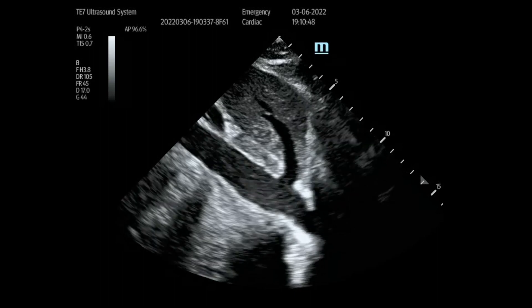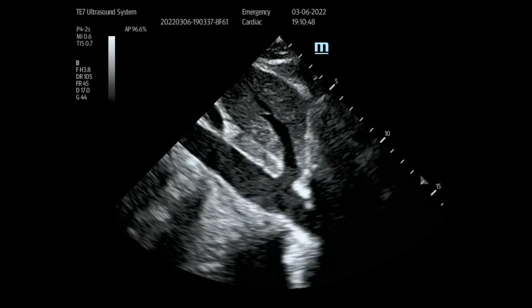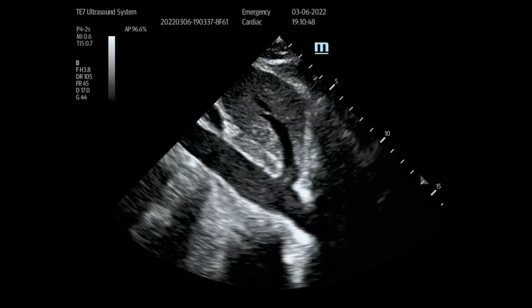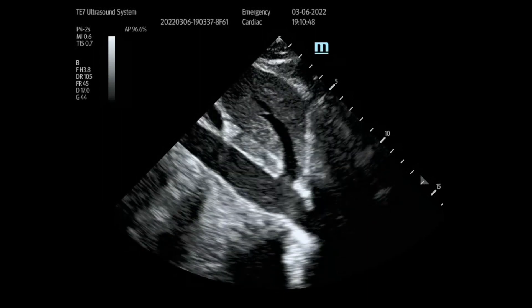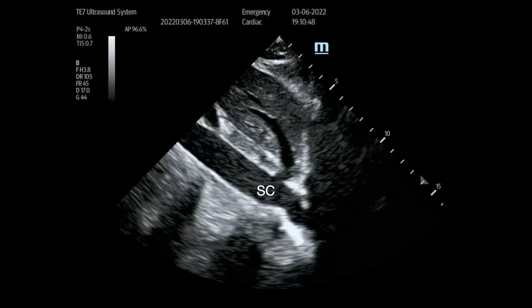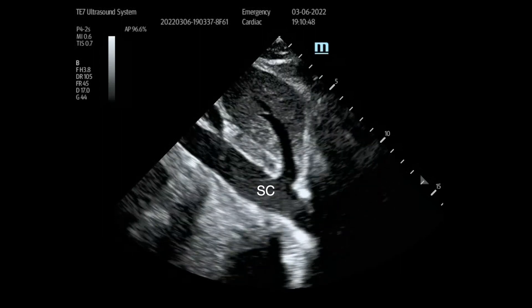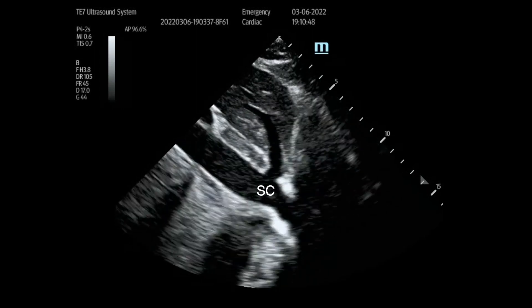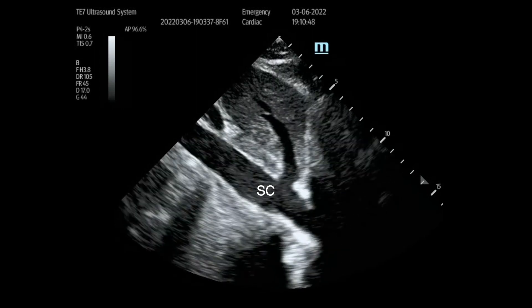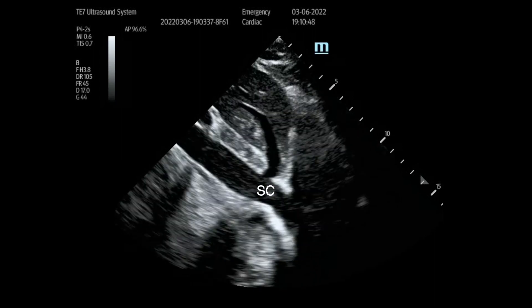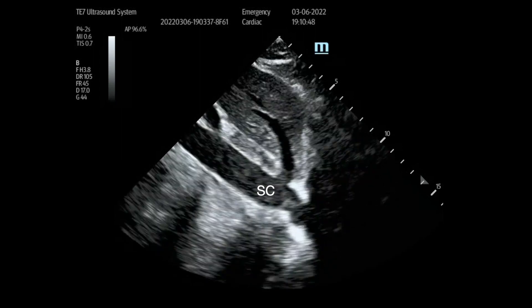Here is another patient who has spontaneous contrast in the IVC. You can see the flow of the IVC going towards the right atrium and you can see the spontaneous contrast. Sometimes it creeps up inside the hepatic vein, which we can see right there.